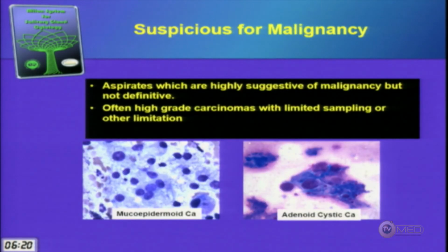Suspicious for malignancy, again, we all know this category very well. It's a standard cytology category. It's for those aspirates of a salivary gland tumor that are highly suggestive of malignancy. I'm pretty sure that that is adenoid cystic carcinoma, but maybe I have a limited sample, I don't have any clinical information, and if I call it adenoid cystic, the patient's going to get a radical surgery. So maybe I'll put it into suspicious for malignancy, suspicious for adenoid cystic, and then our clinicians will do a frozen section and confirm that diagnosis.